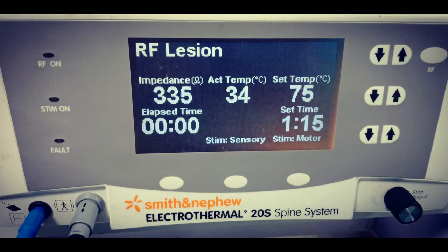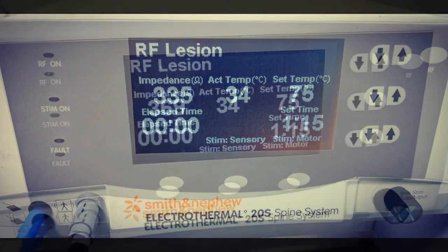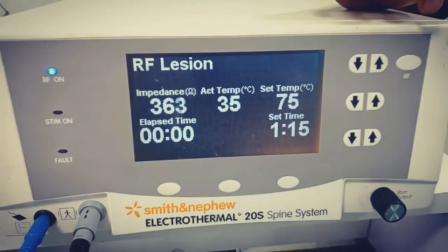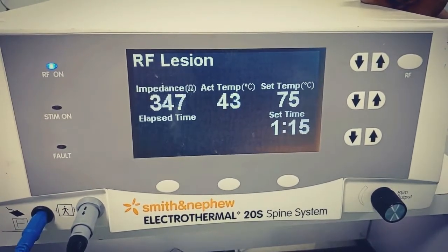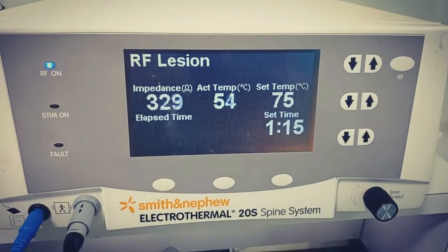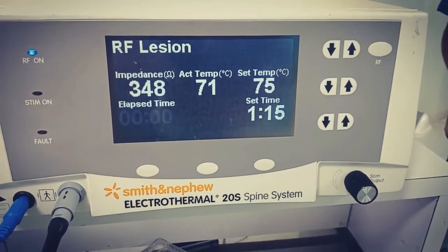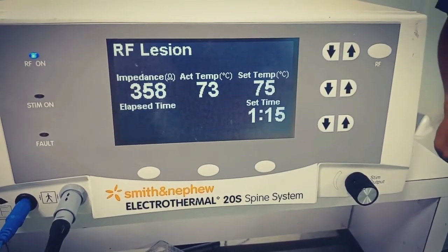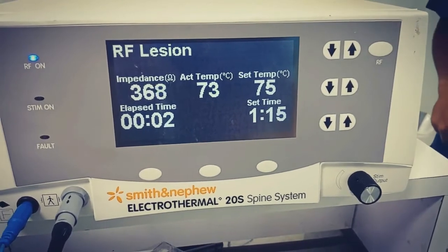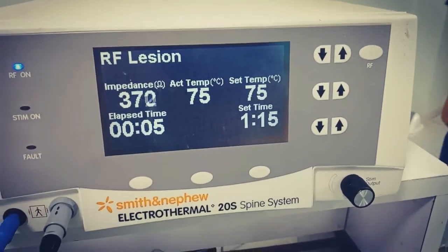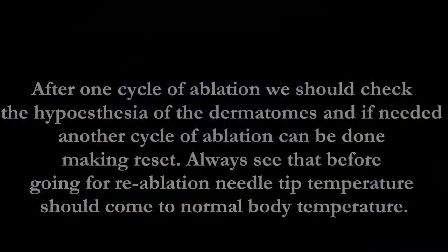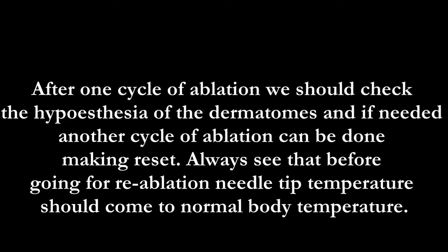Looking at the RF machine: 335 is the impedance, 34 is the body or needle tip temperature, 75 is the set temperature, and 75 seconds is the time. Once the needle tip temperature reaches the set temperature, the time count starts. The procedure has already started — once it completes 75 seconds, it will automatically stop.